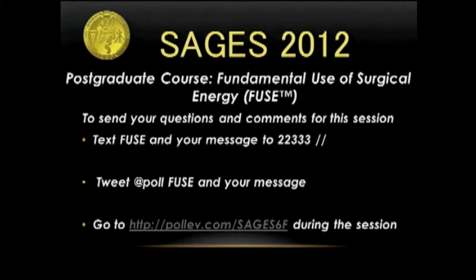Tom? Sure. I think the larger blood vessels that I encounter as a general surgeon would be the splenic artery, which is likely larger than 5 millimeters. So I actually don't use either energy-based device on that. I think if you look at the evidence, a linear GIA stapler is probably the gold standard for laparoscopic large vessel sealing. And then which other vessels are more than 5 millimeters? I think the IMA, the inferior mesenteric artery, is probably right around 4 or 5. And the other larger vessel that I divide regularly would be the ileocolic on a right hemicolectomy. But again, I don't think that's over 5. That's probably 4 or 5 millimeters.